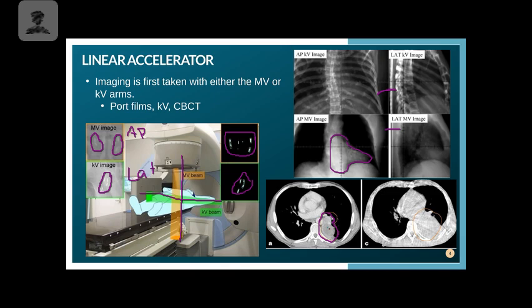very quickly. They don't use as much dose because we're imaging them every day. So we don't want to use a high dose like we would in a normal CT. So C, this image is more likely to be our actual CBCT. It's not going to look as pretty. There's more artifacts that are splattering throughout versus A looks a little prettier. So that might have been more of our simulation photo that we got from the first try.